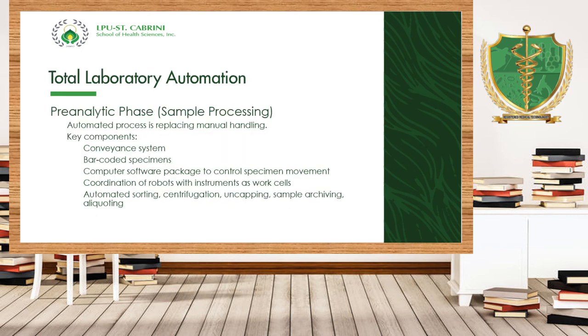Okay? Now, for total laboratory automation, again, we have the pre-analytical, the post-analytical, and analytical itself. Pre-analytical phase is also known as the sample processing. Again, automated process replaces manual handling. Okay, what are the key concepts of pre-analytical phase?